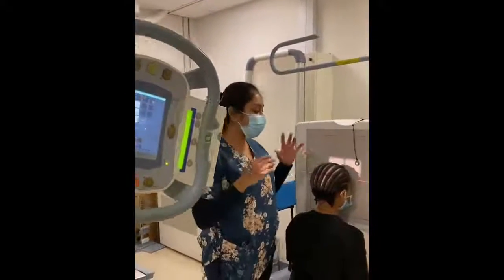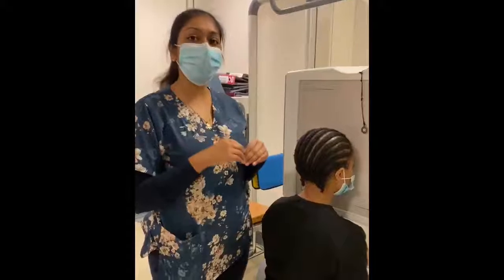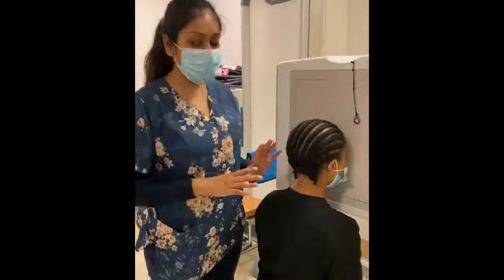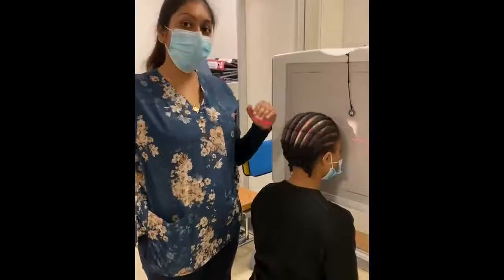Now remember, when you're doing a PA view, you are going to angle caudally. If you are doing facial bones AP, then you can actually angle your tube cranially. So since we are doing the patient PA or OF, we're going to angle the tube 15 degrees caudally.